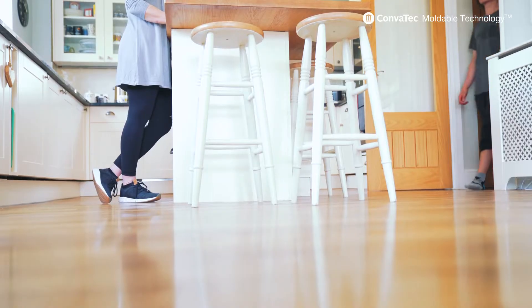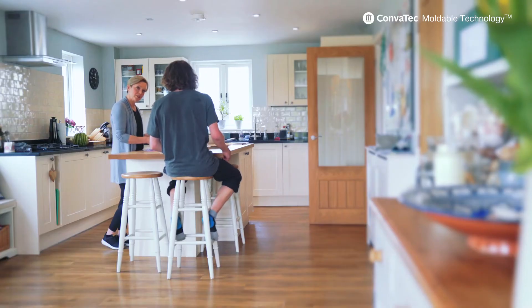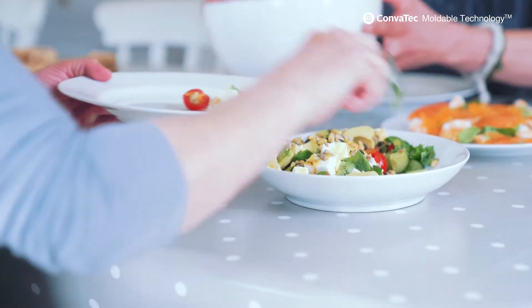The Mouldable product works brilliantly in that situation because it's really secure and sticks really well to the skin. It also allows the stoma to change shape and you still get a really snug fit around the stoma, which is incredibly important to prevent leaks and to maintain security.